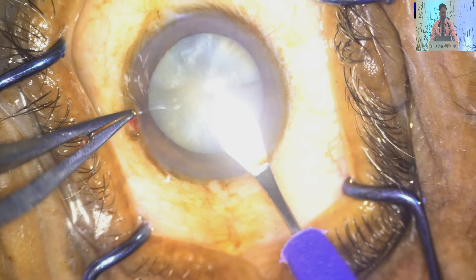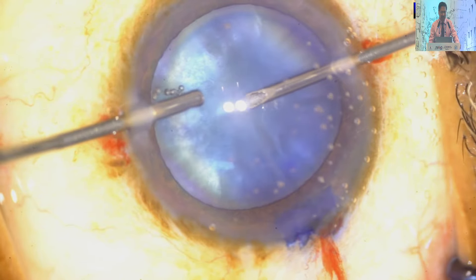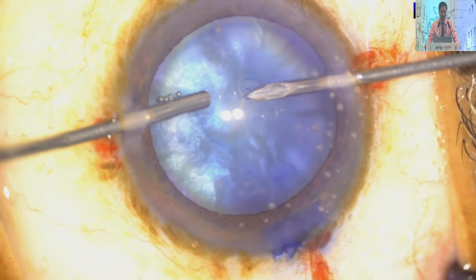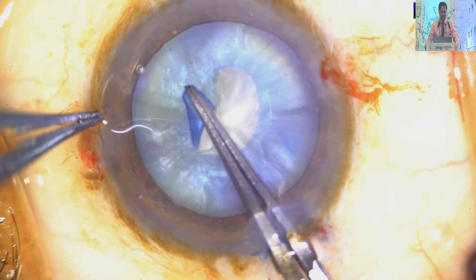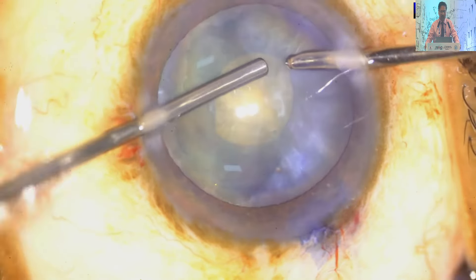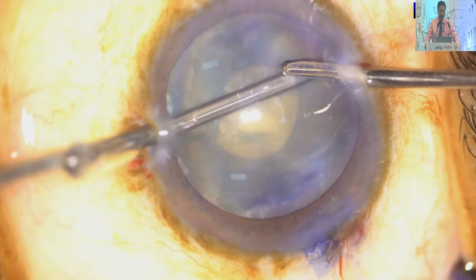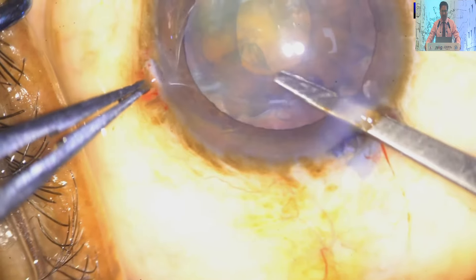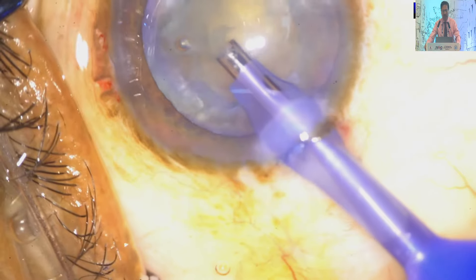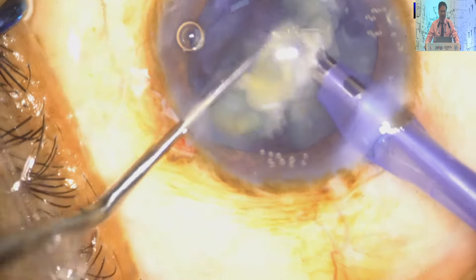It's very rewarding. This is the intumescent cataract — white cataract. Two side ports are made, and now a 24-gauge needle is bent and penetrated inside the capsular bag to aspirate the liquid cortex. From the other end, simultaneously, you are injecting viscoelastic. This is the first CCC — a small CCC. Then I will enlarge it later on. I am taking out all the cortical matter from the capsular bag, as there is high intracapsular pressure in intumescent cataract. We have to decompress and debulk it, and then perform nucleotomy and other phacoemulsification techniques as usual.